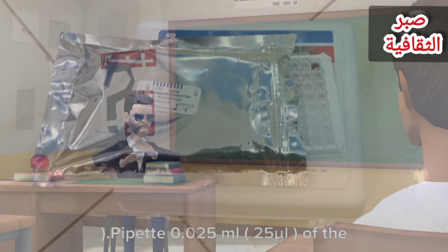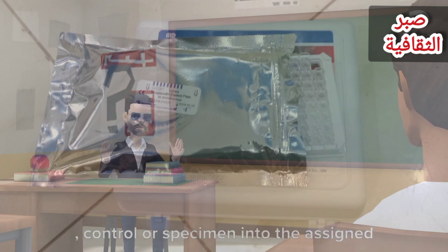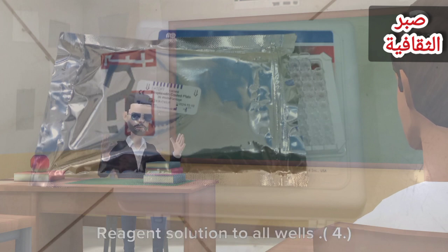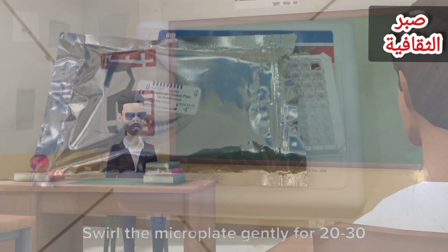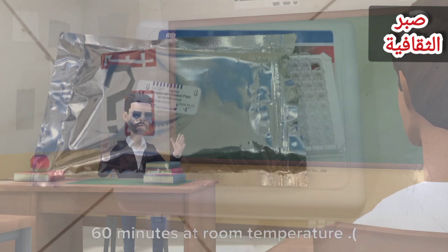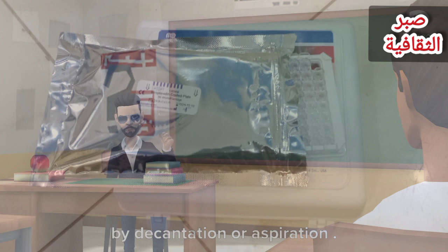Pipette 0.025 milliliters, 25 microliters of the appropriate serum reference calibrator, control or specimen into the assigned well. 3. Add 0.100 milliliters, 100 microliters of PRL enzyme reagent solution to all wells. 4. Swirl the microplate gently for 20-30 seconds to mix and cover.